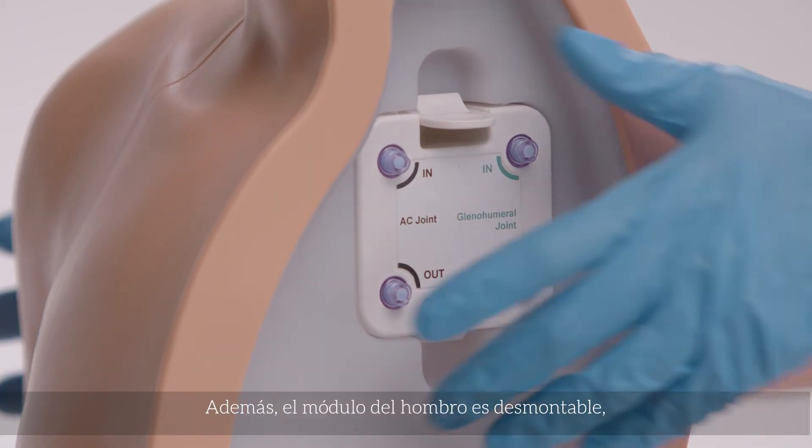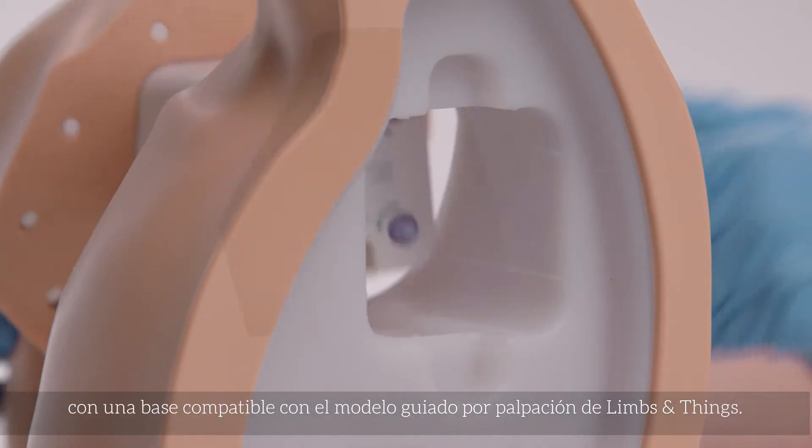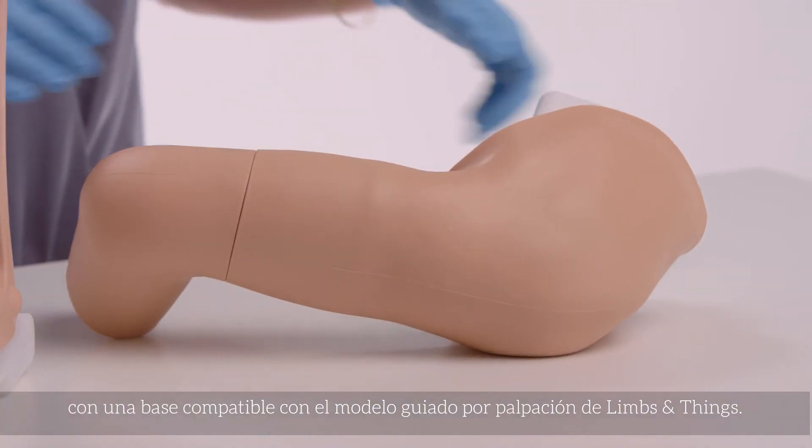In addition, the shoulder module is detachable, with the base unit compatible with the Limbs & Things palpation-guided model.